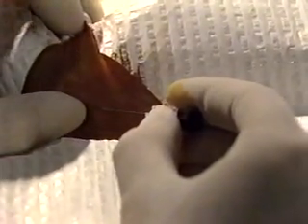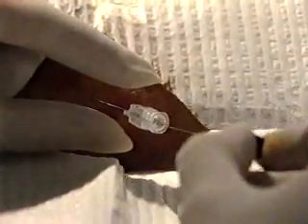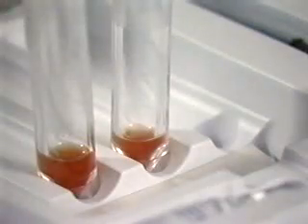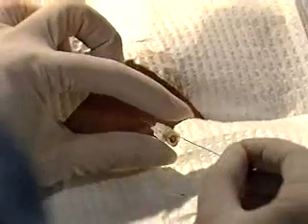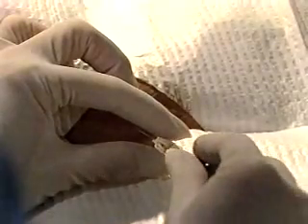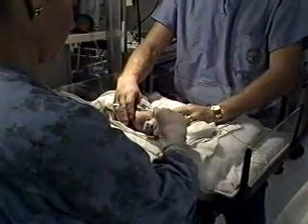The spinal needle is inserted approximately 3/4 centimeter and blood-tinged fluid is immediately obtained. This neonate has a grade 3 intraventricular hemorrhage, which is evident by the free-flowing, uniform, light pink fluid which did not clear through 3 tubes. Note how still this neonate is with very little movement in the spinal needle as compared to the full-term neonate demonstrated earlier. Once an adequate amount of CSF is obtained, the stylet is reinserted into the needle. The needle is withdrawn and pressure is applied to the puncture site using a sterile gauze pad. The sterile drape is then removed, the back is washed, and a bandage is applied.